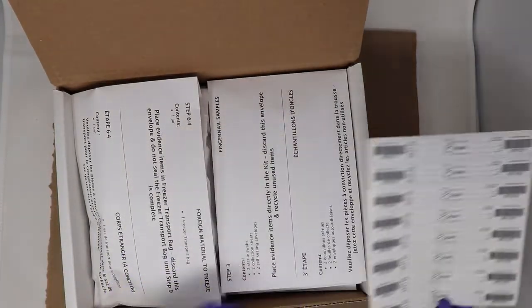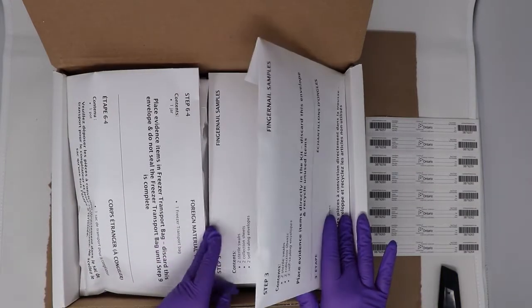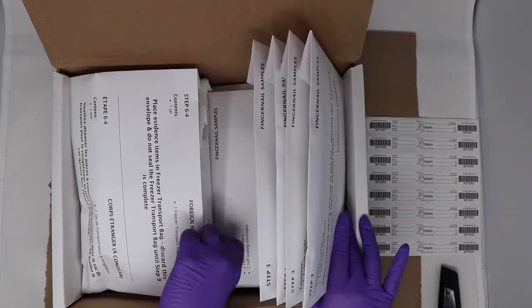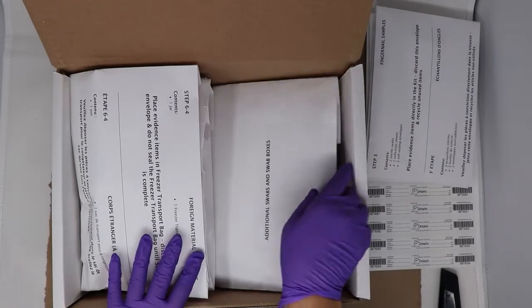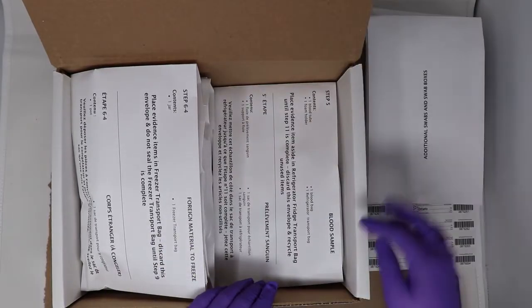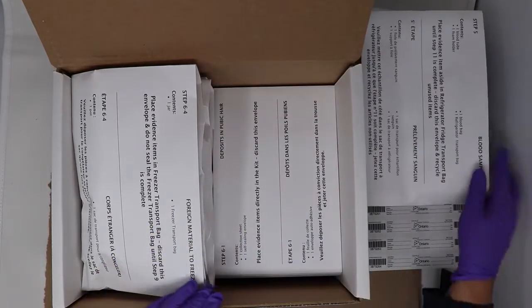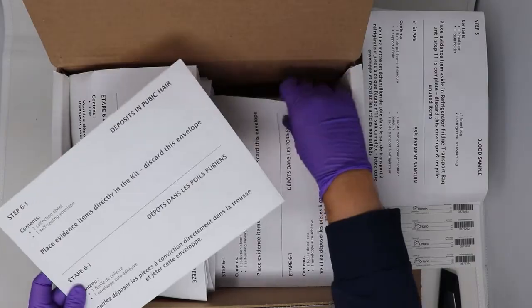Items contained within the auxiliary pack include Step 3, the fingernail samples, additional swabs can also be found in the auxiliary pack. There's an additional Step 5 envelope for the blood sample, as well as envelopes containing materials required for collection of parts of Step 6.